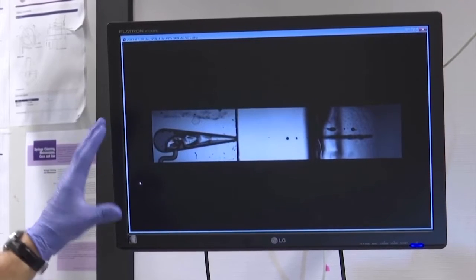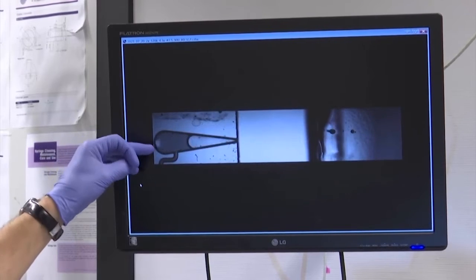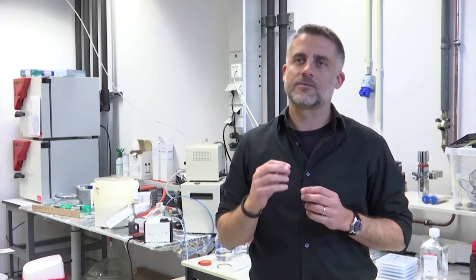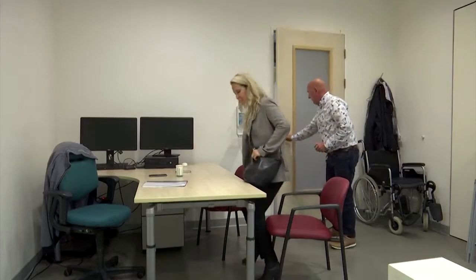The process is quicker than a mosquito bite and should not cause pain, because nerve endings in the skin are not touched, he said, though this will be studied further. We do that by accelerating small droplets of liquid that penetrate in the superficial layer of the skin, and this has many advantages. The first one is removing the fear. Additionally, we contaminate a lot by the needles that are used, and our immune system works very well when you inject into these superficial layers of the skin.